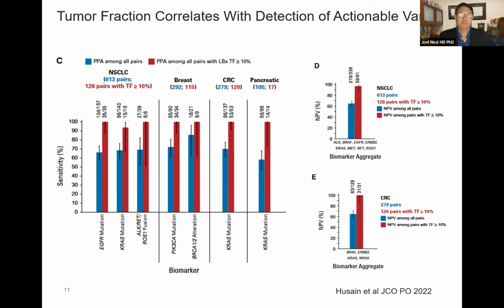The whole companion diagnostic FDA thing, I think it mucked it all up, because there are certain tests that are approved for certain companion diagnostics, and then they'll put those at the top, and then other mutations will be like, hey, this might be important, but this is another mutation. So the 10 things that are actionable in lung cancer, EGFR and all the rest of them, those should be at the top, like, do this with this.